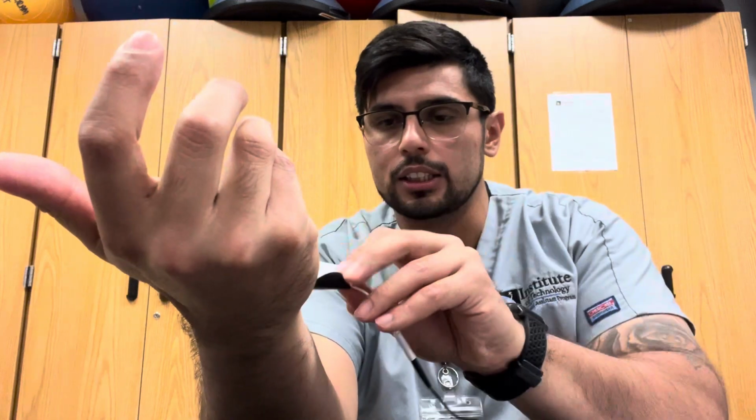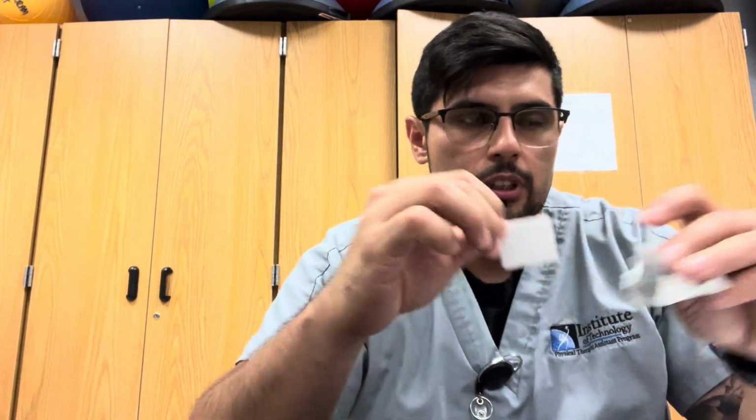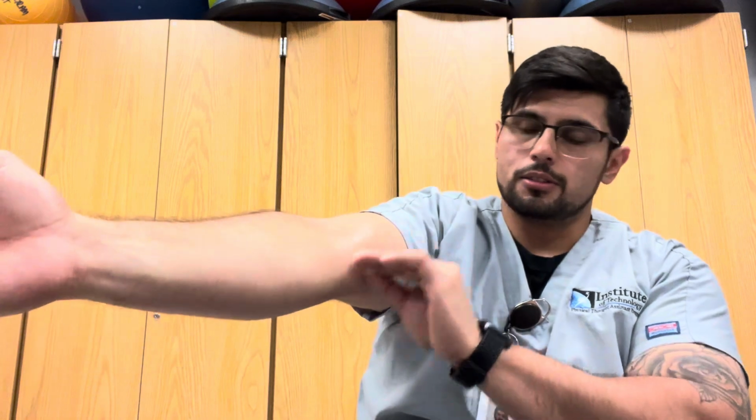So we're going to go ahead and take an electrode off. And you want to put it more towards like a linear path, right? So there. Oop, wait. Let me get another alcohol pad real quick. I went a little too low. Get the pad. Again, clean here. I'm going to use more of the elbow area, not the forearm. Right, so right here.